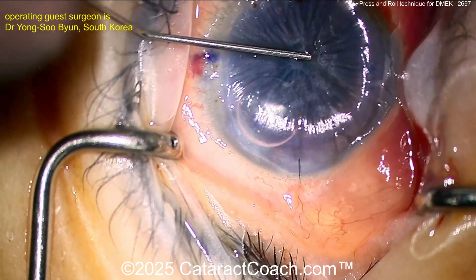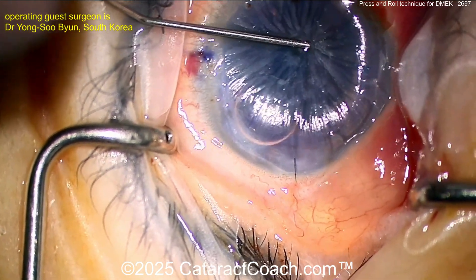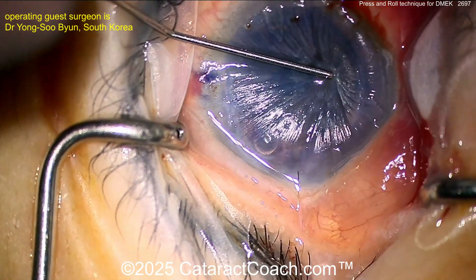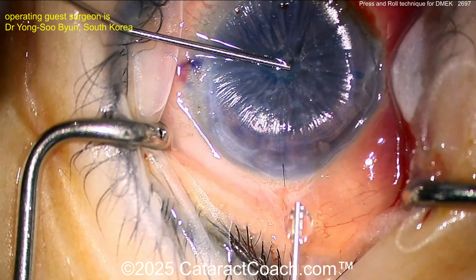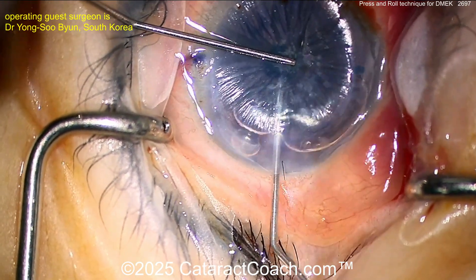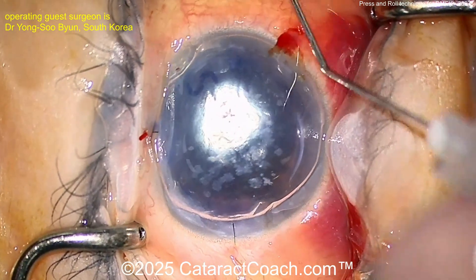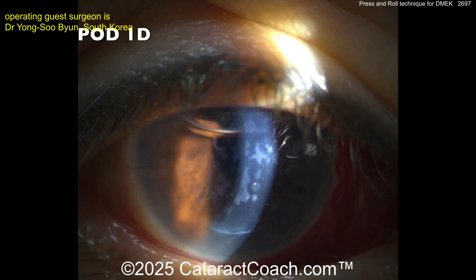Rolling the bubble around helps open up the graft in the press and roll technique. Once that's done, the small bubble is removed and the final large bubble is placed underneath the DMEK graft, then its positioning is confirmed with OCT. This is described as a brilliant technique.